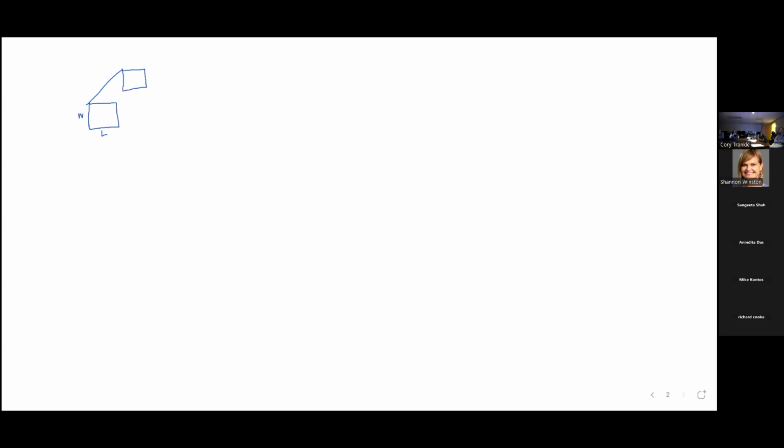That's right. The voxel has the depth, right? And inside this voxel are the protons. These are all the little guys in there that are doing their spin thingy.